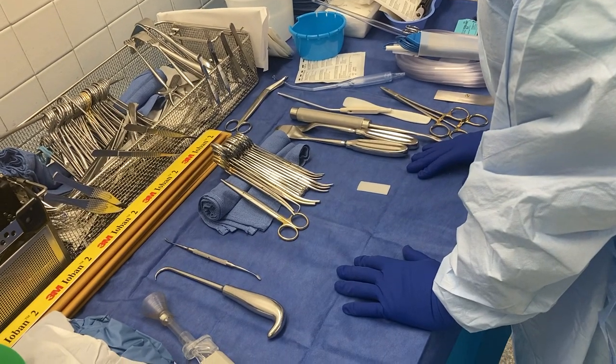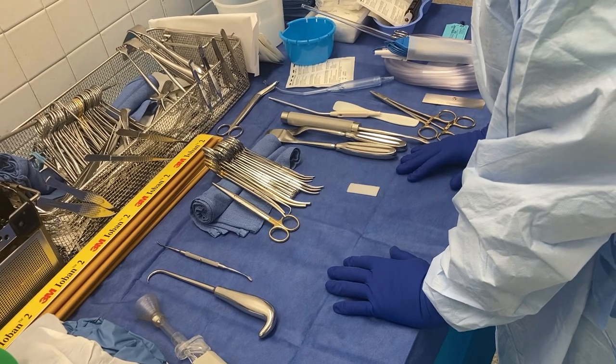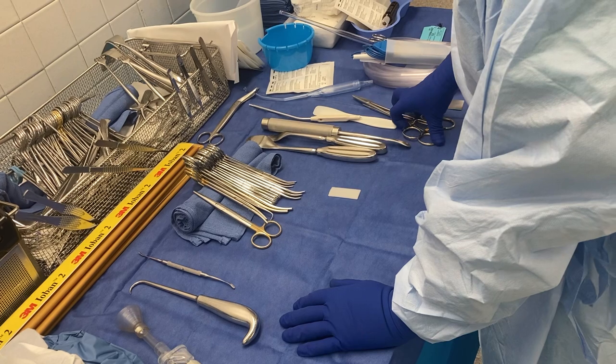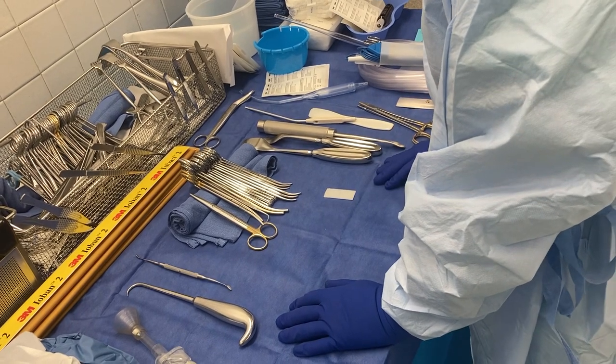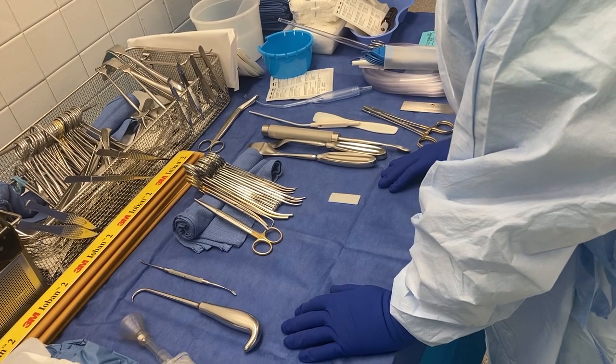We're doing an above-knee amputation on our patient today on the right side. The X-Fix is on the left side. I just want to run through the thought process of doing amputations, at least in the orthopedic world, and some instruments that you want to pull out and things that you want to think about.